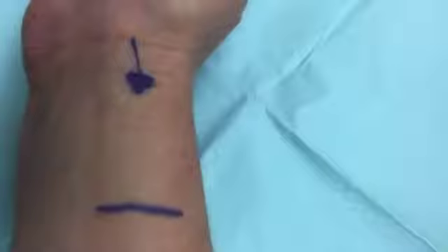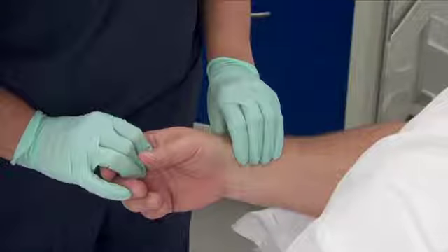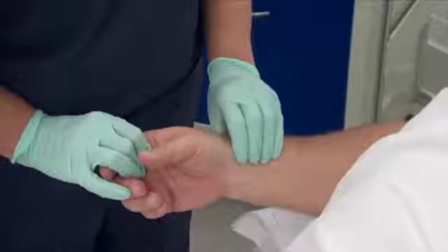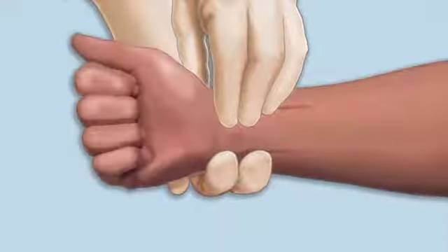This zone shows the optimal insertion area for radial insertion to minimize mechanical complications. Prior to a radial arterial catheter insertion, an Allen's test is performed to confirm adequate collateral circulation. An Allen's test is performed by compressing both the ulnar and radial arteries.